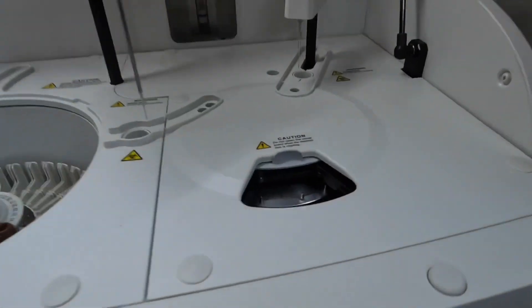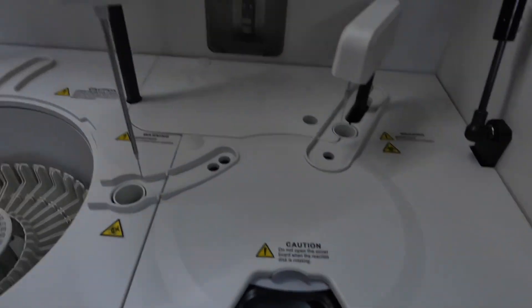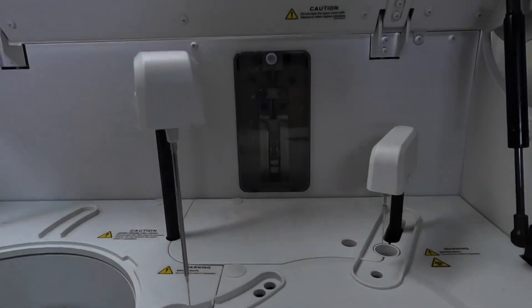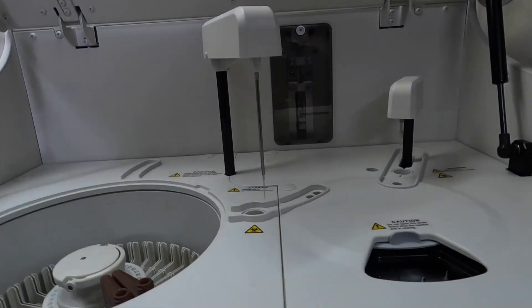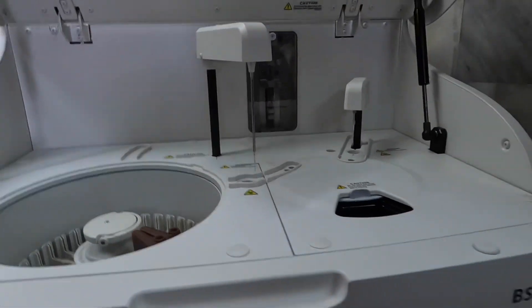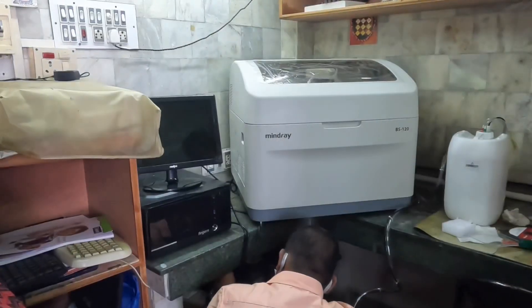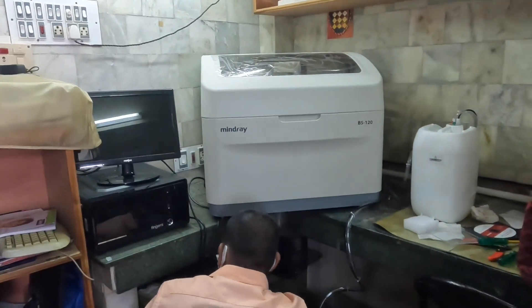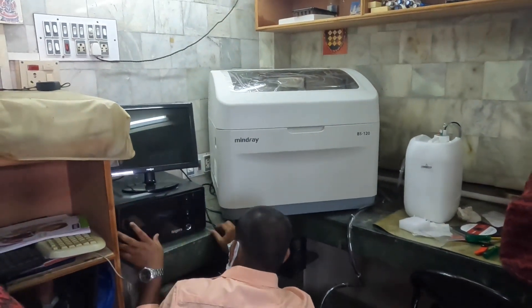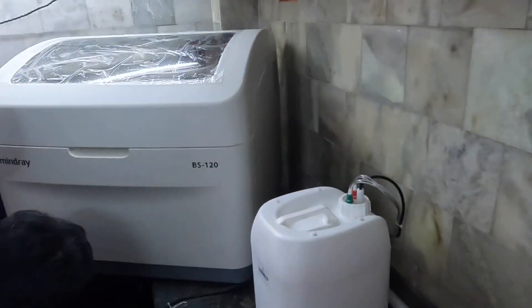This is the area where we are going to load the reagent, and this is the cuvette loading area. These are the two probes which came with the machine, and this is the inside of the machine, over which we have a cover. It is mandatory for the AC to be on when the machine is running; when on standby, the AC need not be on, but it must be on while the machine is in the running position.